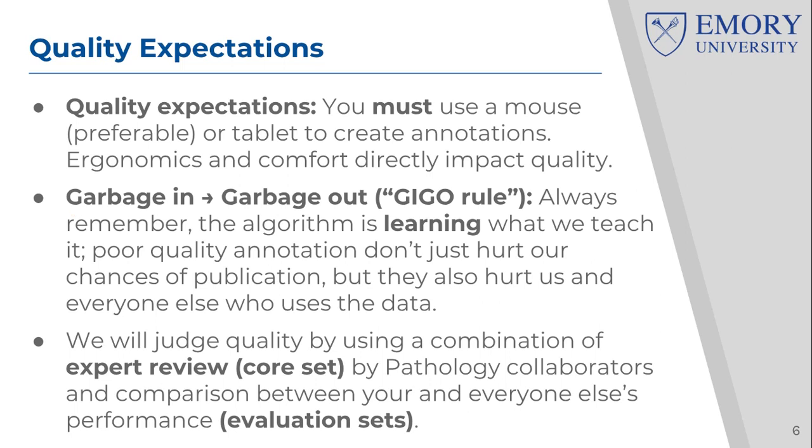that algorithms are going to be using to learn how to do what you are doing manually but automatically. Okay, so if you tell the algorithm this is what a tumor cell looks like, and the quality of your data is good, then the algorithm is going to really learn the correct rule, right? So it's very similar to human learning. If you give garbage data or poor quality data, the learning is going to be bad, right?